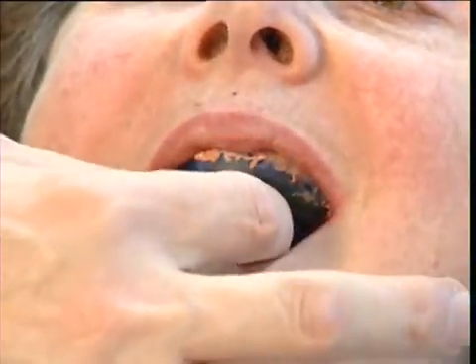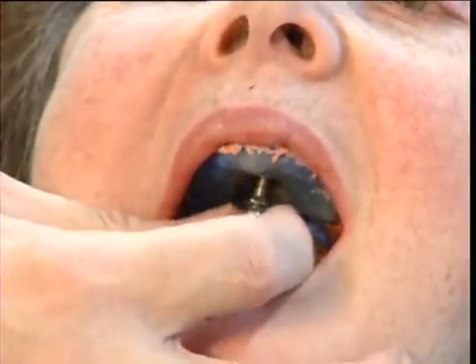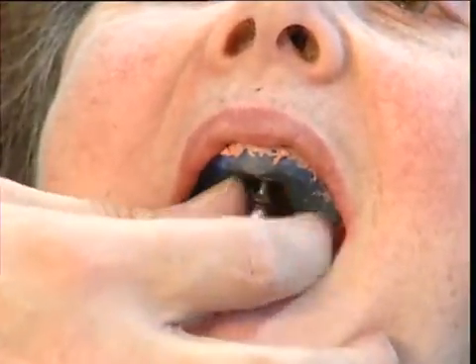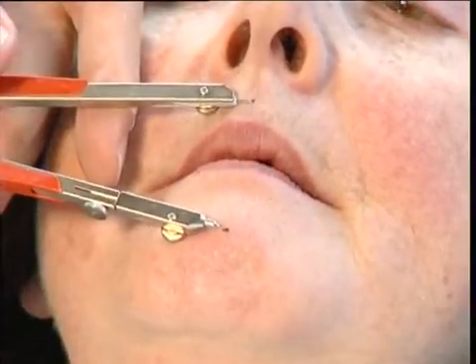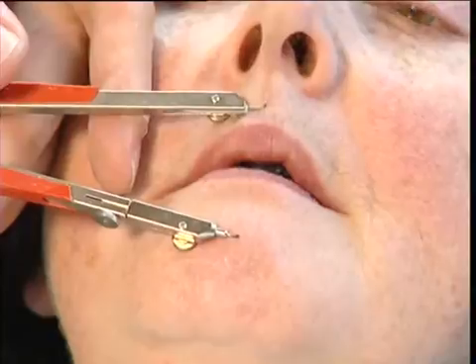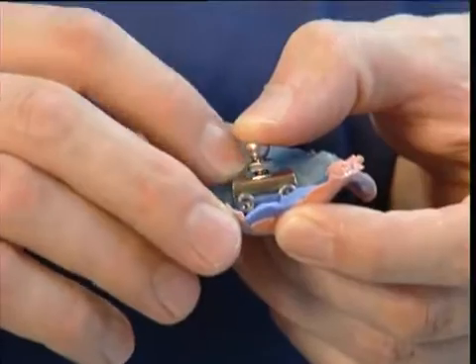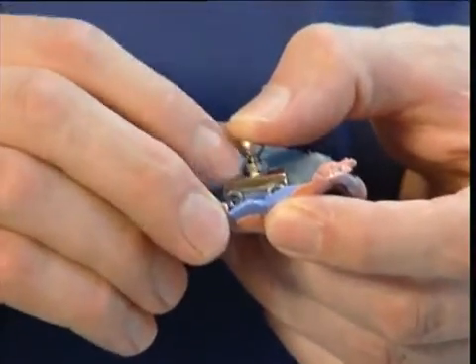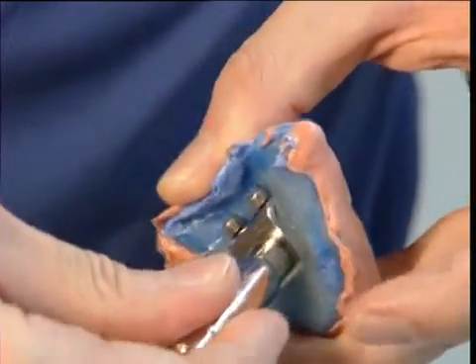In the mouth, the tracing ball is wound in until it meets the requirements. Even without prerequisites, the prosthodontist can evaluate the vertical dimension and adjust it in either direction with the vertically adjustable tracing ball until the patient assumes the physiological position. The tracing ball is tightened with a counter nut. The upper tray must be removed from the mouth and the nut tightened with the universal wrench.